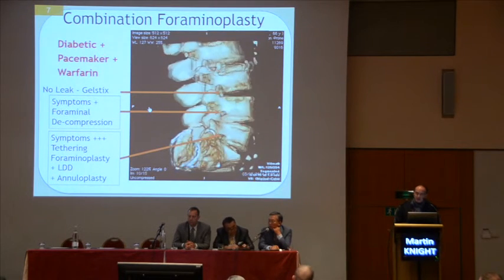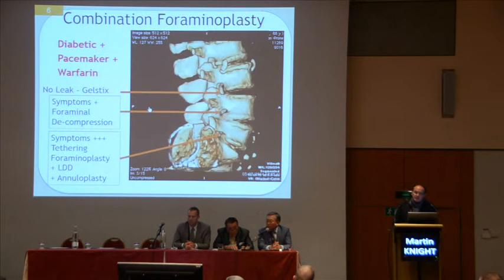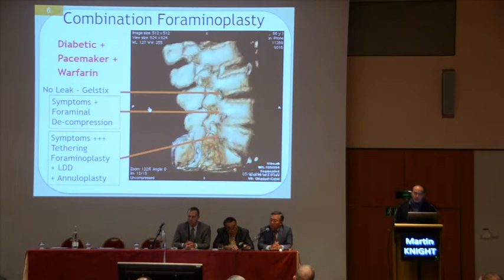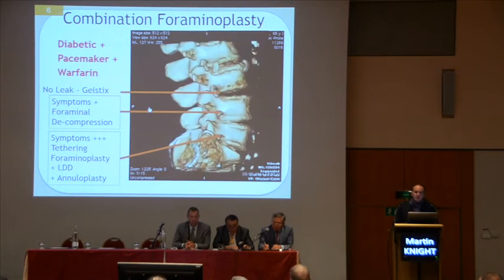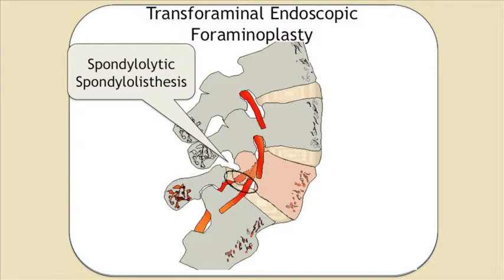So here I need to define, the upper of those two levels had more like a simpler endoscopic foraminotomy, but the lower level where there was lots of tethering had the full foraminoplasty with mobilization throughout that foramen. You've heard the use of these techniques with spondylolytic spondylolisthesis. You saw a lovely case just a moment ago from Michael. Here we're doing the same thing.